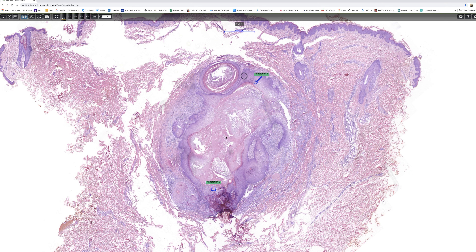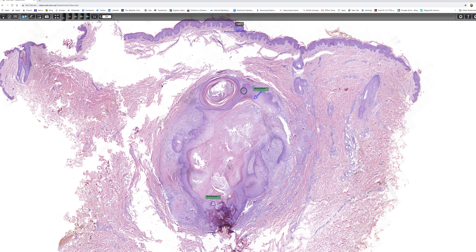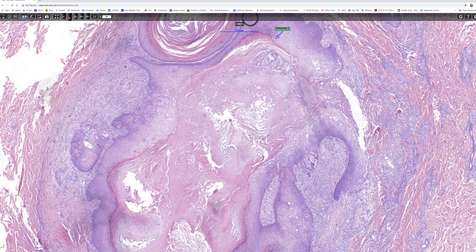So there's a cystic cavity and it's lined by stratified squamous epithelium. And at the top, there's a budding cyst which looks very like a conventional epidermoid cyst.